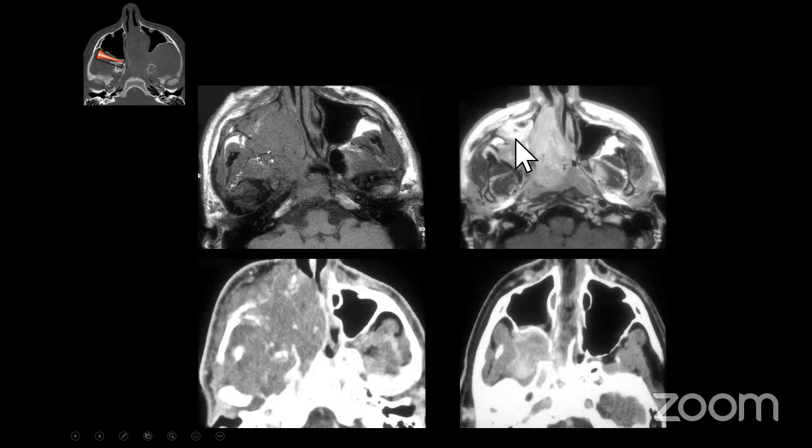You could also see here, if you look at the posterior wall of the maxillary sinus, it's a little bit pinched. And again, with the leap of faith, you can actually see the lateral and medial pterygoid plates, and they're intact. So when you look at these, you can see that this tumor is a little bit slow growing. It has enhancement, and it has multiple flow voids. So this is your juvenile angiofibroma.